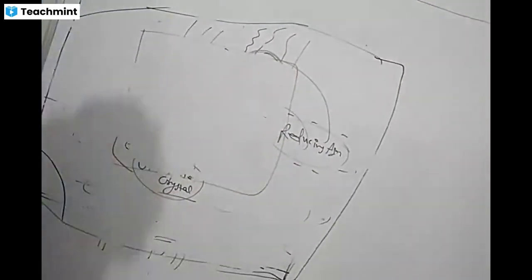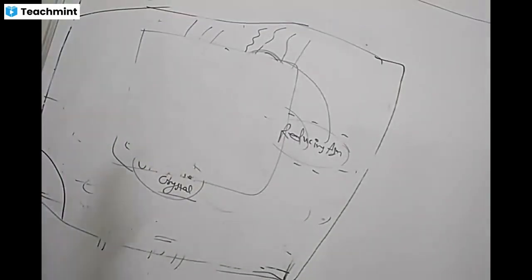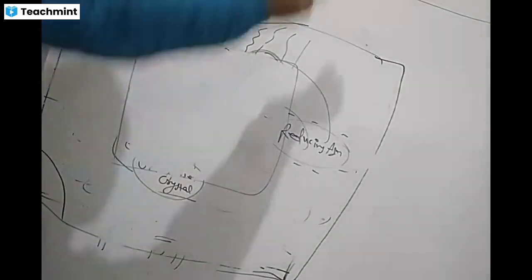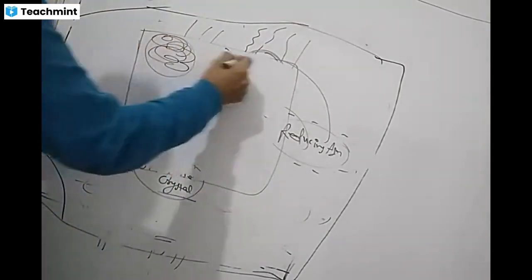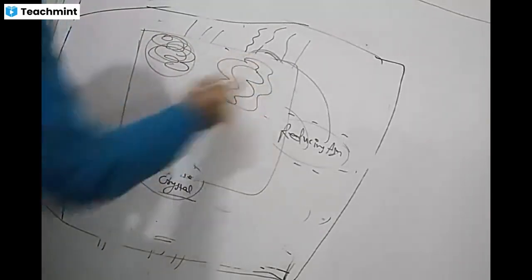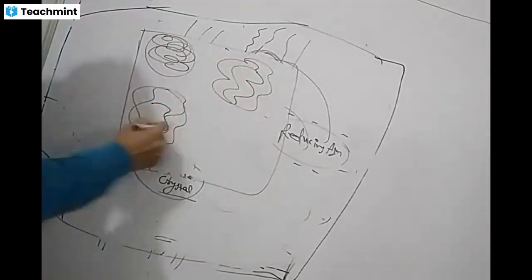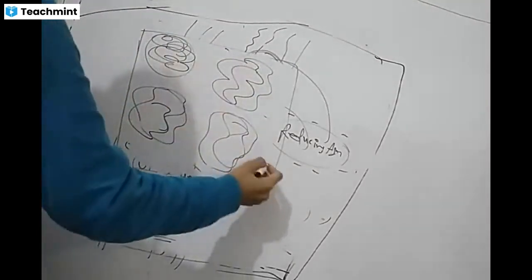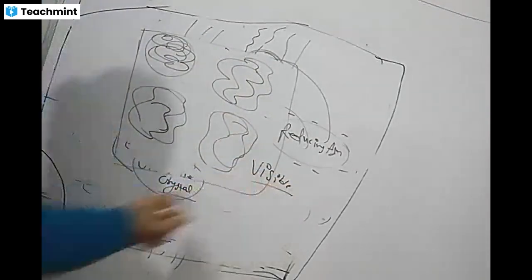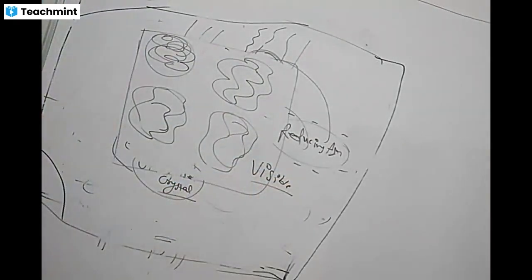So now if you pass your emulsion or your film through the developer, then the whole crystal will be like this, and it can be easily visible. So this is how a latent image is converted into a true visible image because of the reducing agent.